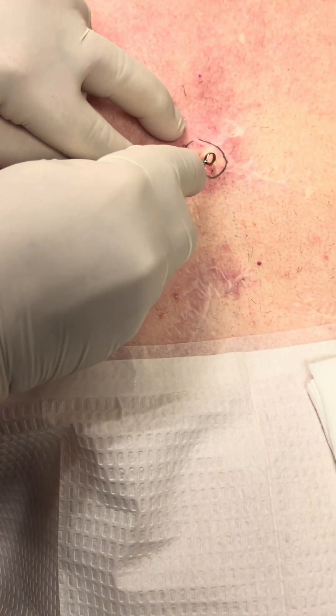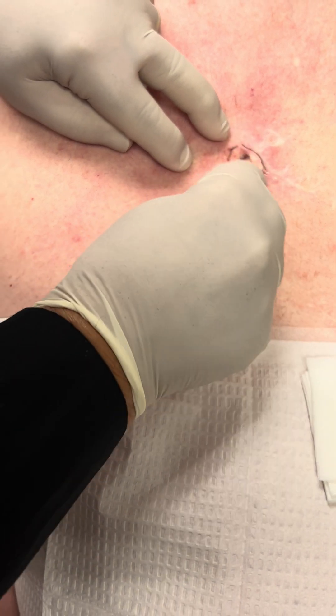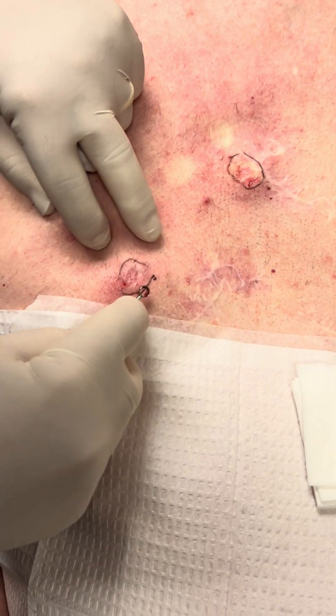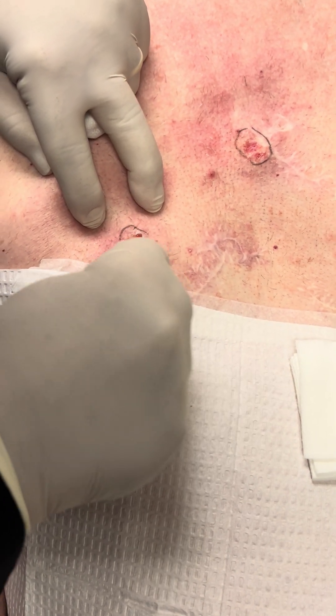Now we cure at it where it's red. We're going to cure at the other one. And this gives you an idea where the edges are.